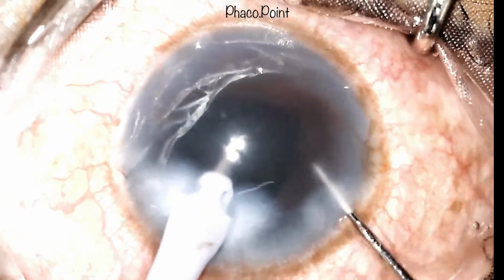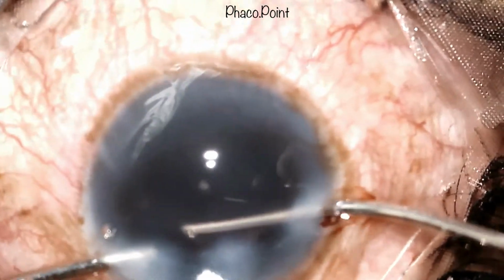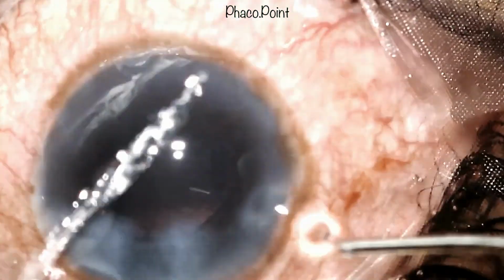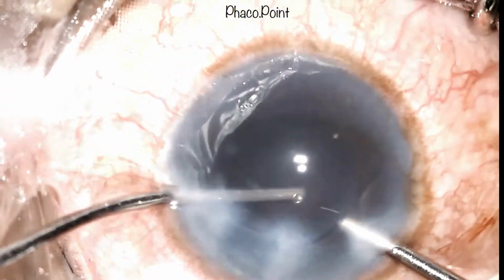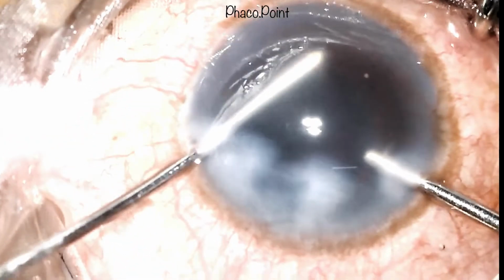At the end of nucleus emulsification, the instruments are removed from the eye and then we proceed with the bimanual irrigation aspiration. The biggest advantage of a bimanual irrigation aspiration is that the hands can be swapped and the aspiration can be reintroduced from the other side. In this way, we are able to achieve a circumferential removal of the cortex. Unfortunately, let's see what happens here.